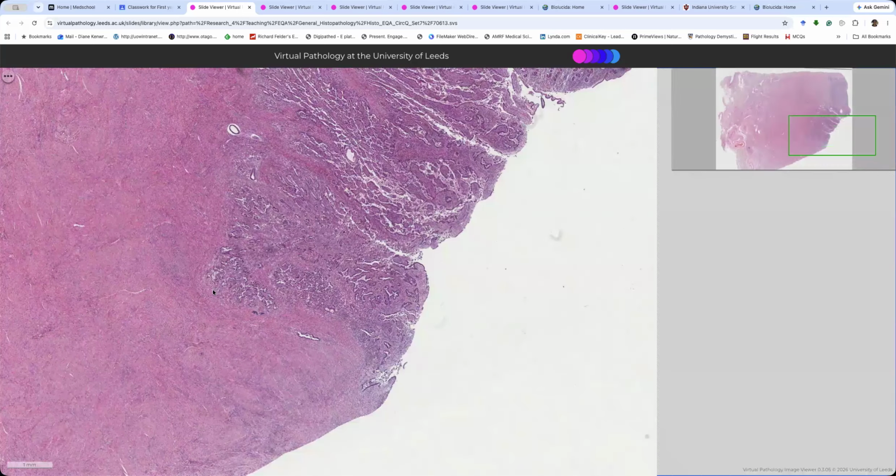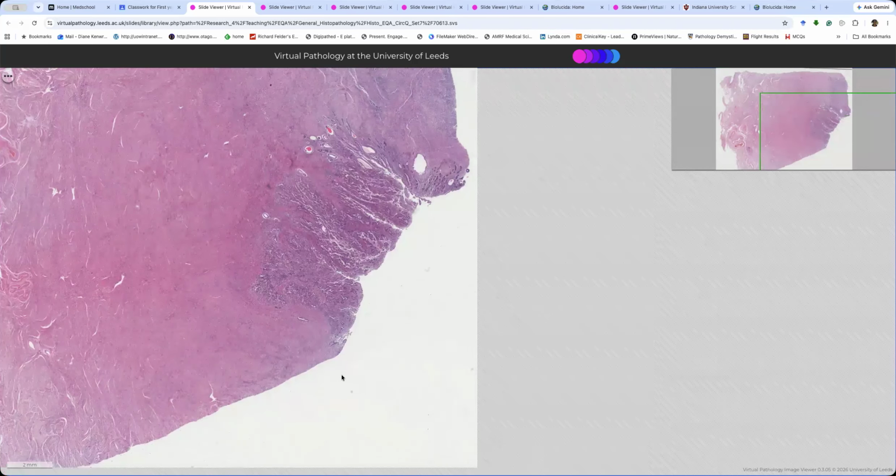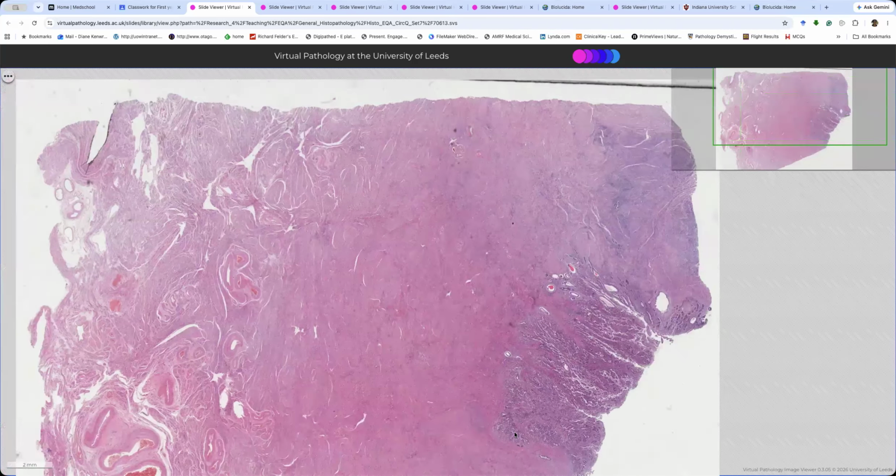It used to be that you could maybe do a CD10 until they discovered it wasn't that good. CD10 stains endometrial stroma. Theoretically, you can find the end of the stroma with a CD10, but then they discovered that particularly endometrioid can induce CD10 positivity around it, and that was no good. Right, so let's decide what the depth of invasion is.